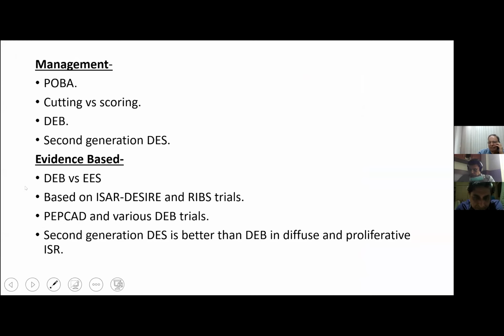Underexpansive ISR is an ISR where there is an undersized or underexpanded stent. The residual stenosis has now become a recurrence, which we need to fix most of the time with balloon-based therapy. But proliferative ISR is a true ISR, which is the most challenging ISR. If the preparation is not done properly, and if you prematurely deploy the stent, like in calcium, this can also give recurrence, stent thrombosis, and whatnot.